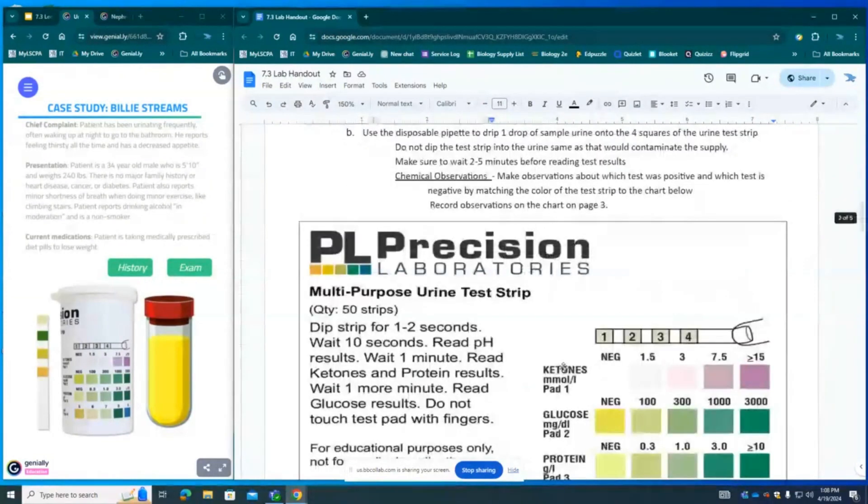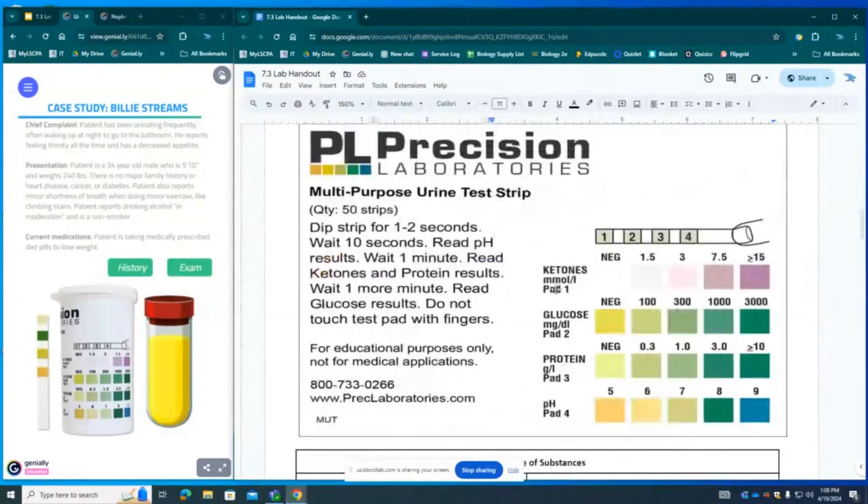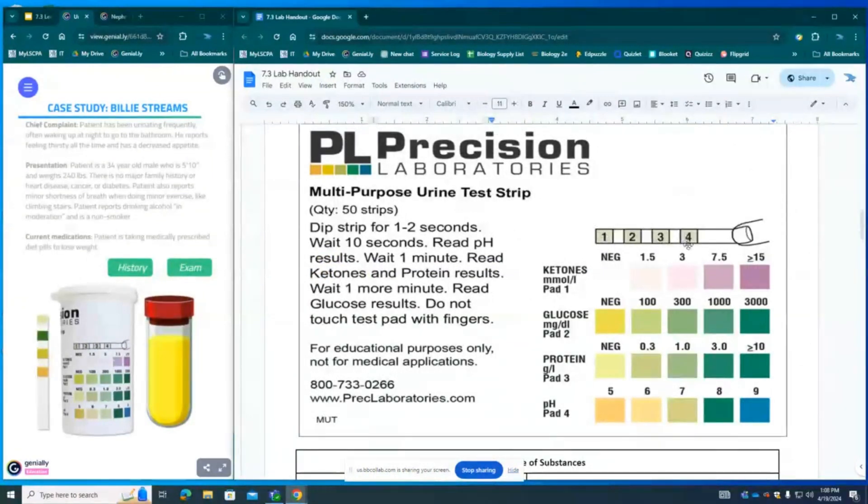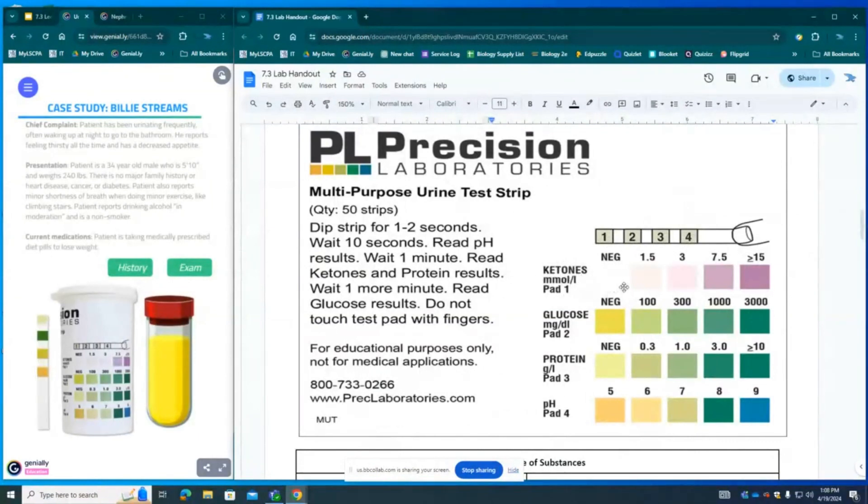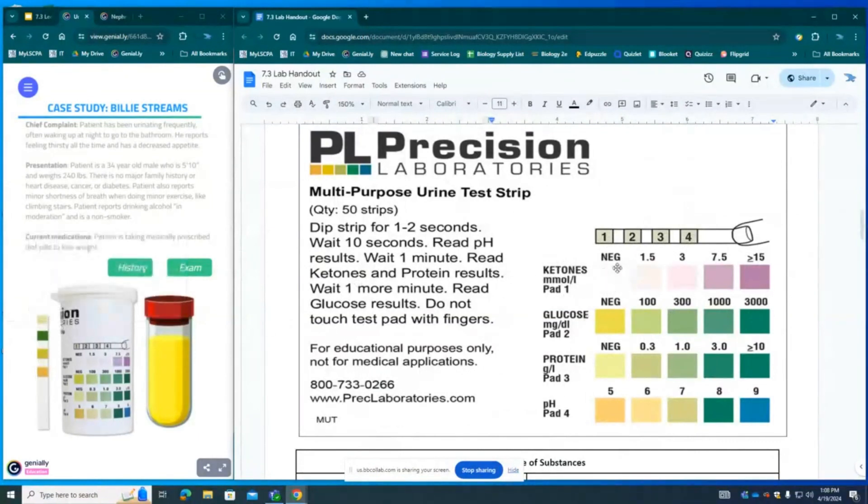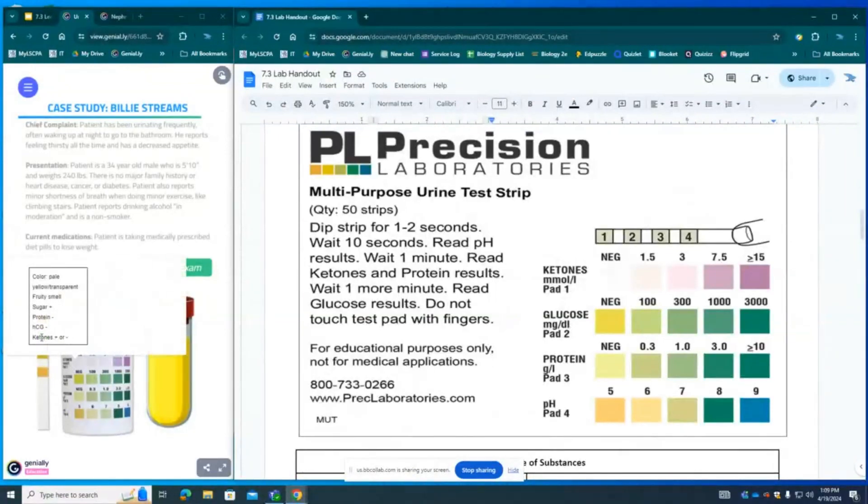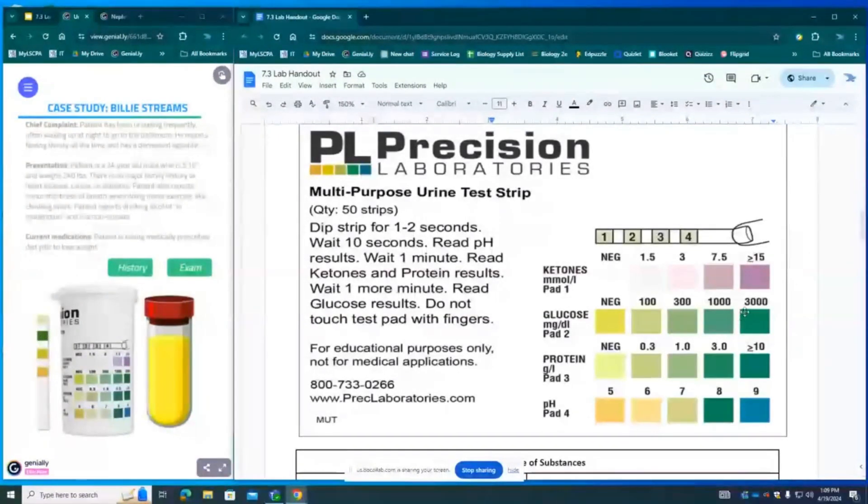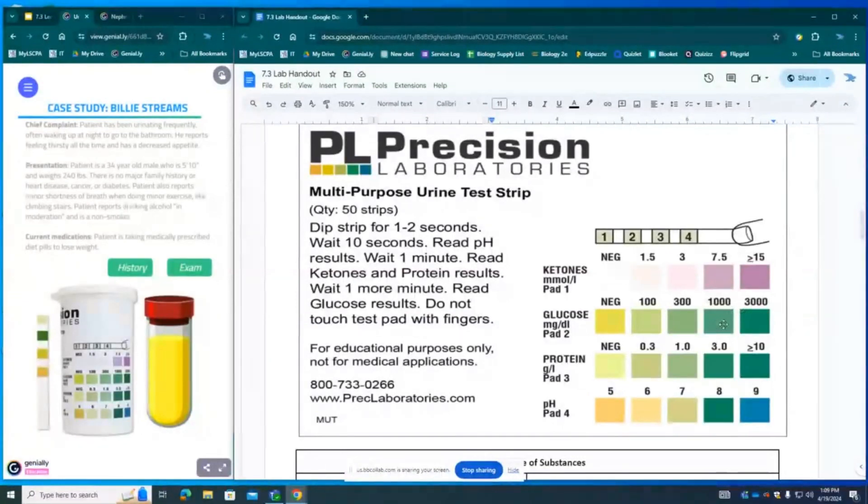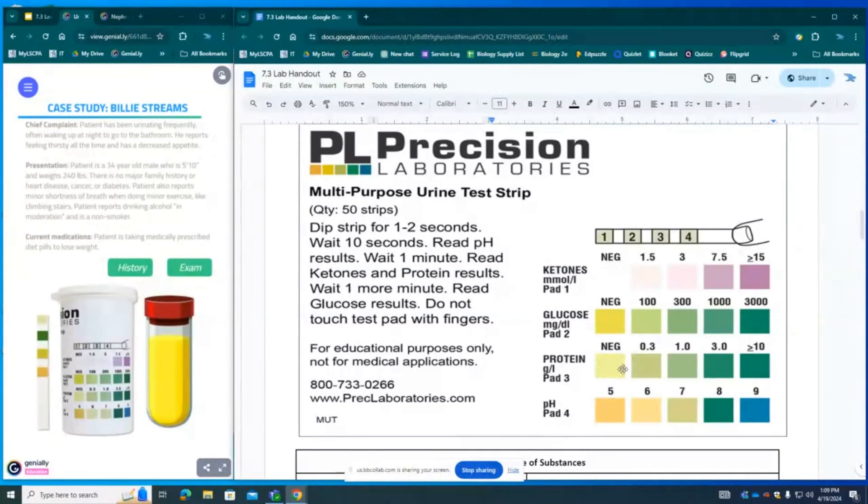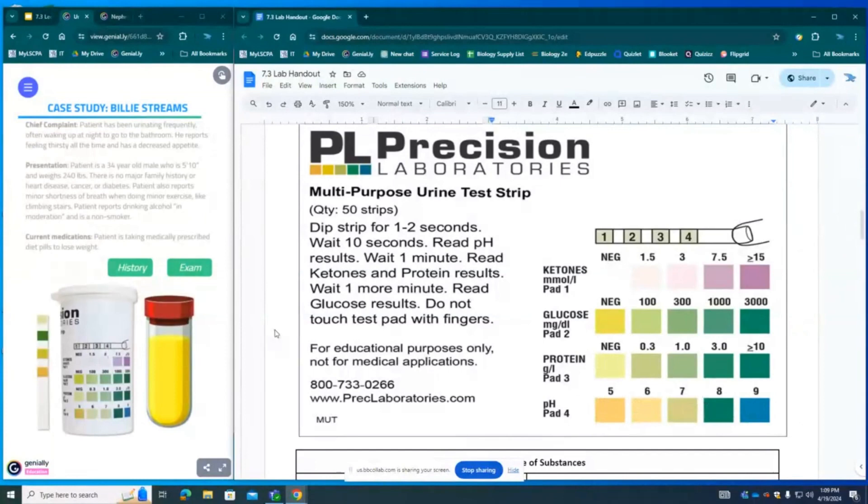Now these test results. These test strips have four different little boxes. We're not going to be using the fourth one but we're going to use the first three. The top one is negative on this test strip because you see no coloration. If it had turned purple that would have indicated a positive result. The second box however is dark green on this image which indicates a very high amount of glucose in the urine which is highly unusual. And then we have a brownish coloration which is a negative result and an orangish coloration which we are not paying attention to.